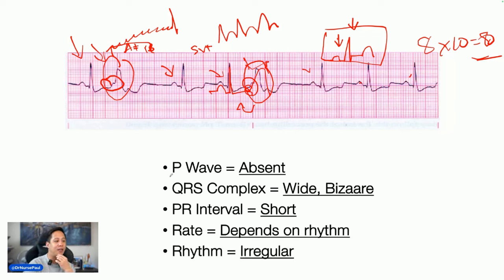It's very irregular. You see the T waves. We had one patient before. I was seeing PVCs and the doctor didn't want to do something. I said, doctor, let me tell you something, all right? This patient has a history of CABG. He's having PVCs, 8 per minute. We got to give him something. He said, no, we'll wait for the cardiologist. We're going to admit this patient. I was like, I'm just telling you, I'm putting a note about it that you don't want to do something about it. Well, what do you know, guys?